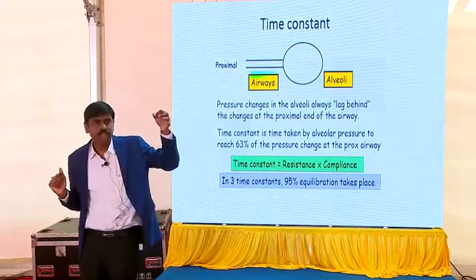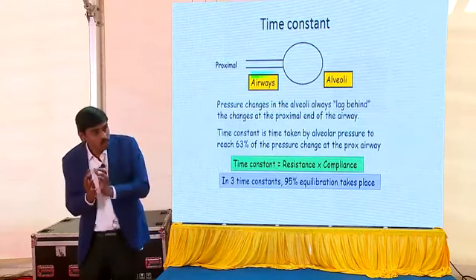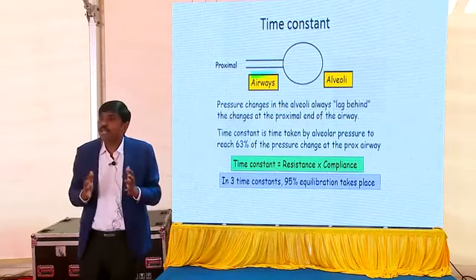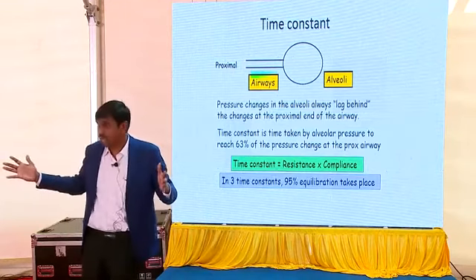You got a narrow airway here. You have to build up the pressure here. Now slowly the air will come in little by little and fill up the alveoli, so it's going to take a longer time. So in BPD, if you're going to ventilate a baby long term, say at 1 month for a BPD spell, you keep a little higher I time.